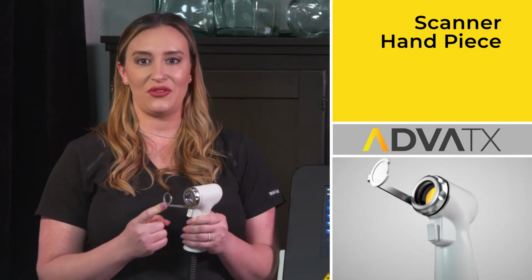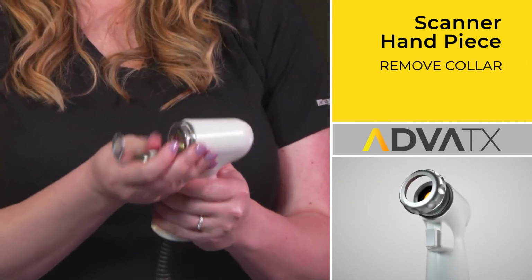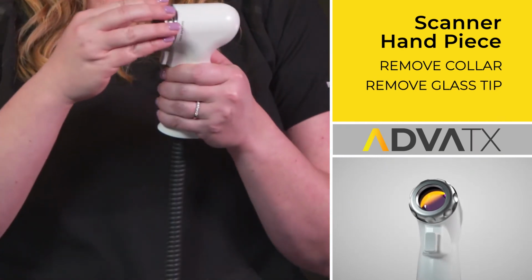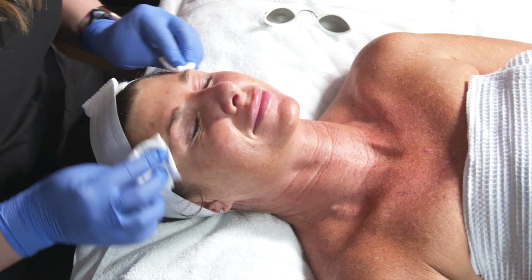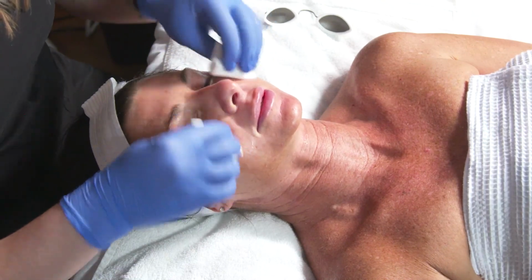When we're finished with a 589, we simply unscrew the collar, remove the sapphire glass tip, and reattach the collar. You also want to make sure that you remove the ultrasound jelly from the face and make sure the skin is very dry before proceeding with the 1319.